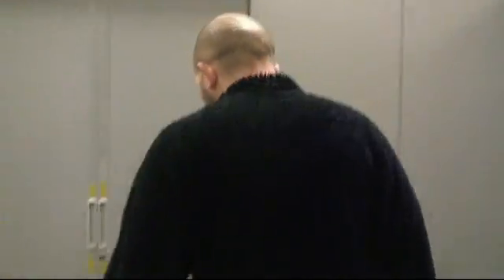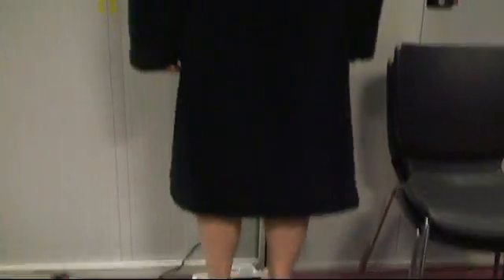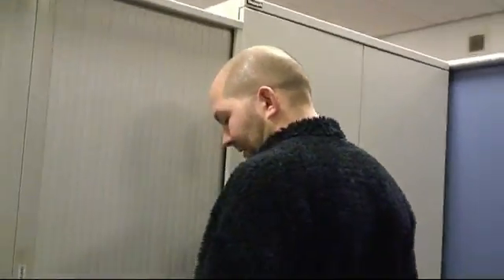Once you've changed down to your undergarments and put your dressing gown on, you'll come out and begin the measurement process. This initially starts with a number of manual measurements and we'll begin with weight. You'll step onto the scales and once your weight has been determined, the technician will record the output.